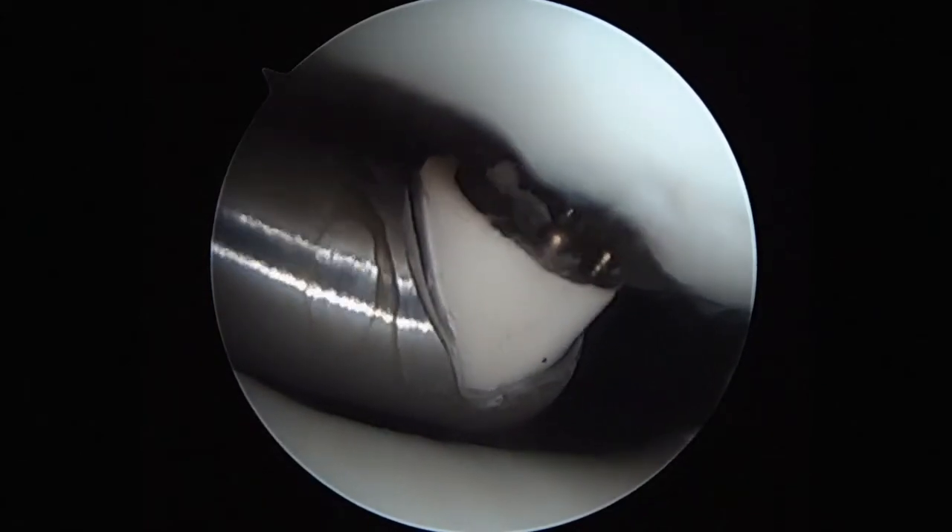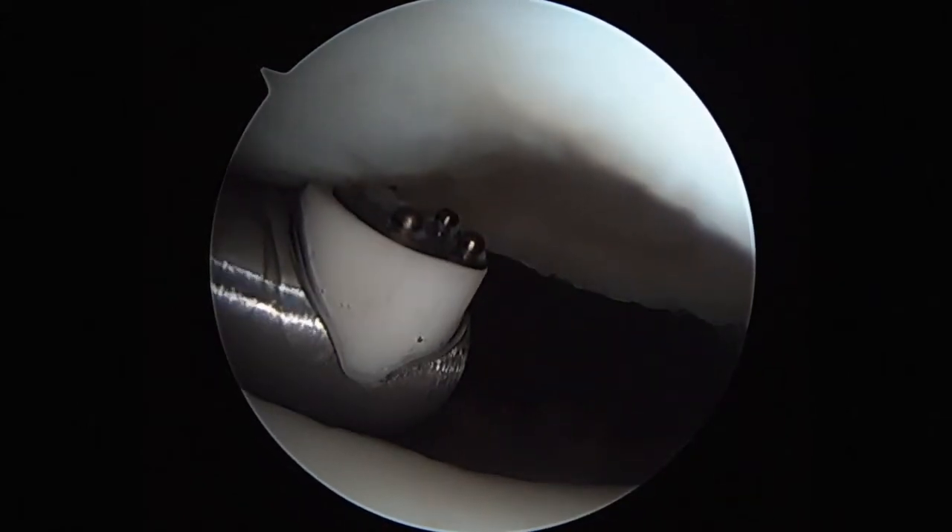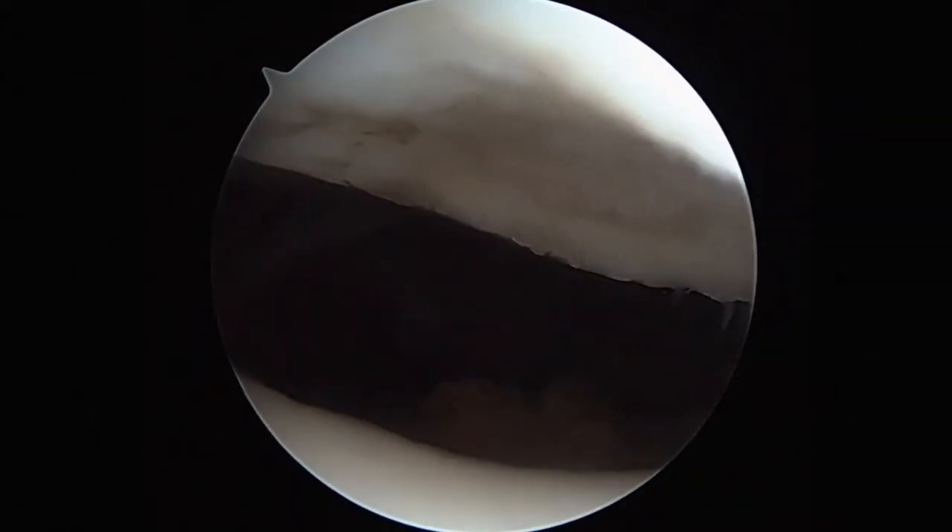As you can see, the patellofemoral compartment is well inflated by the fluid energy pump, and with this technique a smooth chondral surface is manufactured.